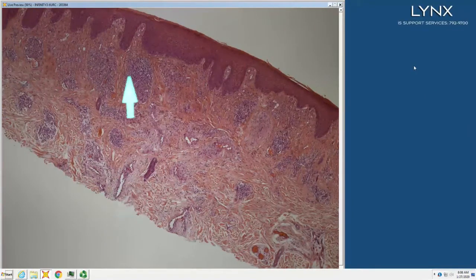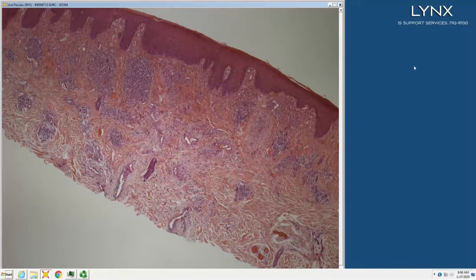Hobnail endothelium, and you said the words quite a bit of inflammation. Put that together. What do we have? The hobnail hemangioma. So hobnail hemangioma would be targetoid hemosiderotic, but what is the other hobnail? Is it the angiolymphoid? ALHE. Exactly, angiolymphoid hyperplasia with eosinophilia. Well done. Pass that easy button.